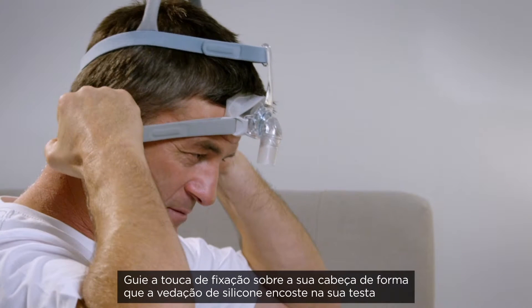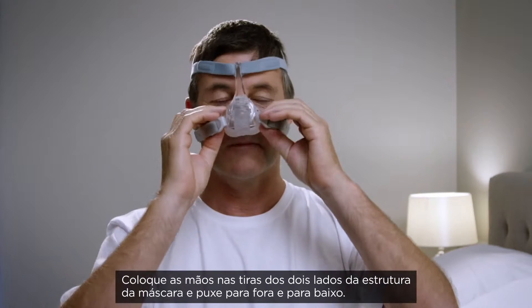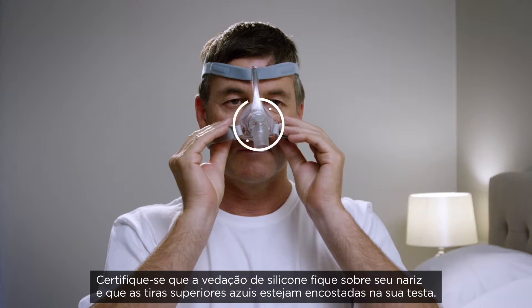Guide the headgear over your head so that the silicone seal is resting on your forehead. Place your hands on the straps either side of the mask frame and pull out and downwards. Ensure the silicone seal rests over your nose and the blue top strap is sitting on your forehead.